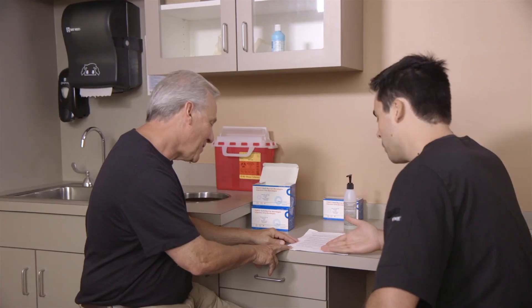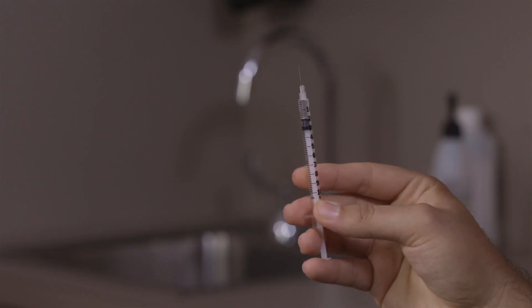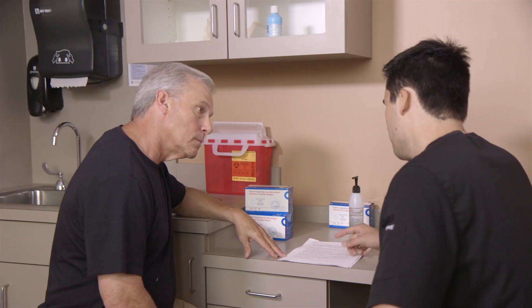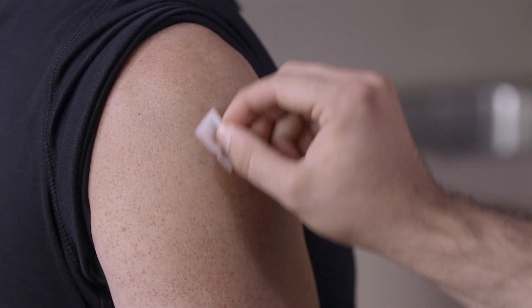This second demonstration is for a subcutaneous injection. Similar to the intramuscular injection, prepare the syringe for the injection consistent with your company or APHA's procedural guidelines. Following the preparation, review the injection procedure with your patient. Prepare the injection with an alcohol wipe.